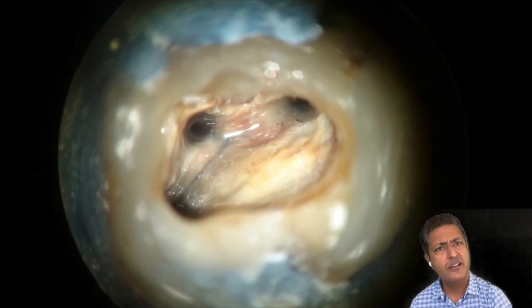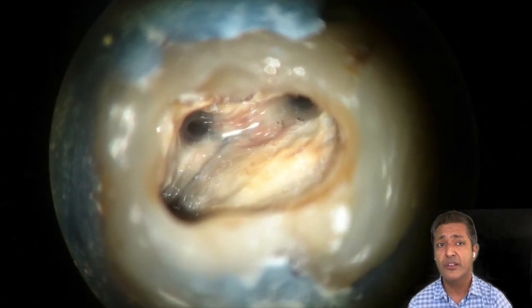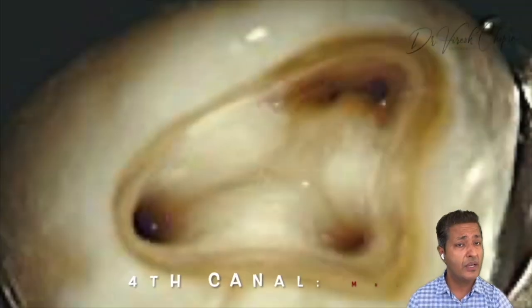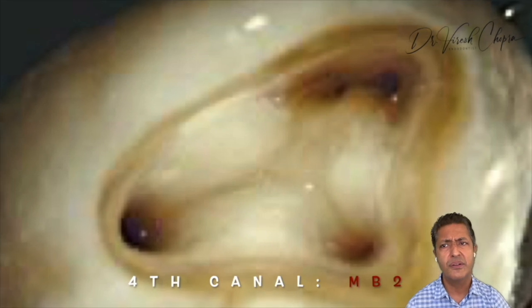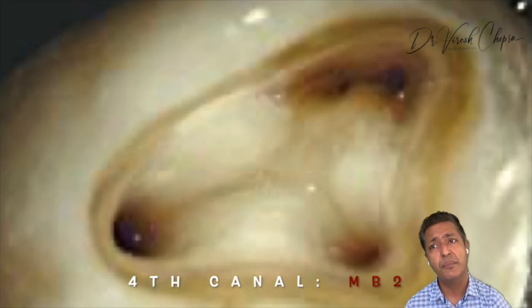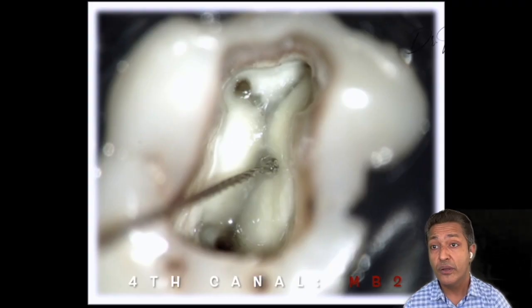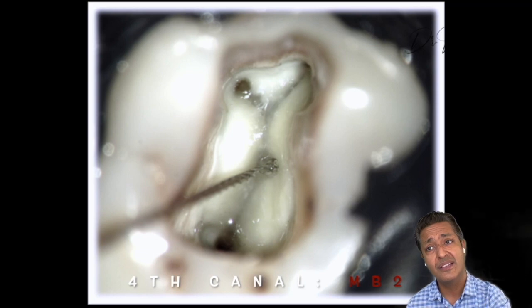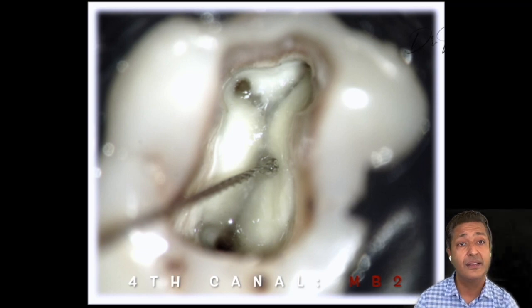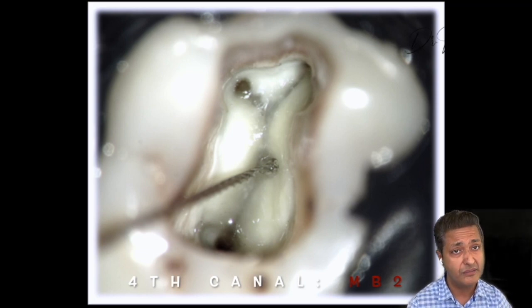However, there is a high incidence of finding a fourth canal, which we call the MB2 canal, and the orifice of the MB2 canal is most commonly present somewhere between MB1 and palatal. It can be closer to MB1, as you can see on the screen, or it can be somewhere between MB1 and palatal, as you can see just now that it is actually in the center of MB1 and palatal.